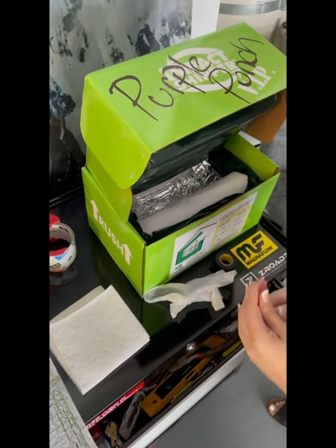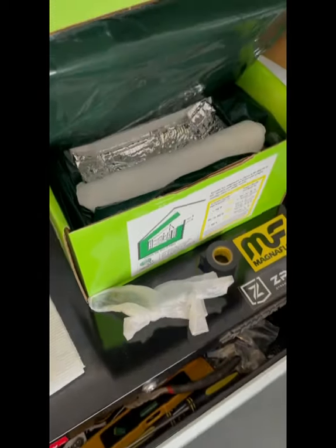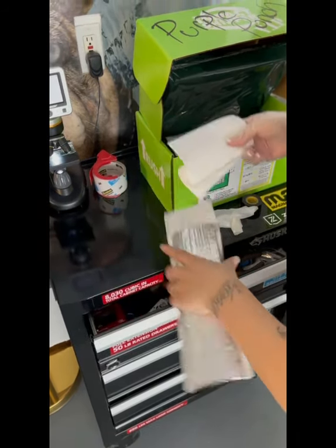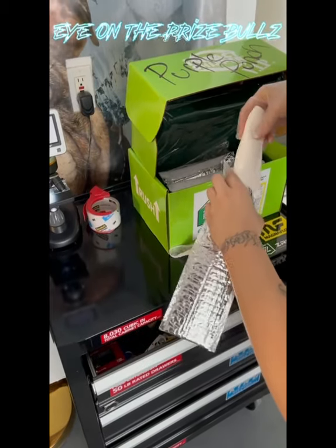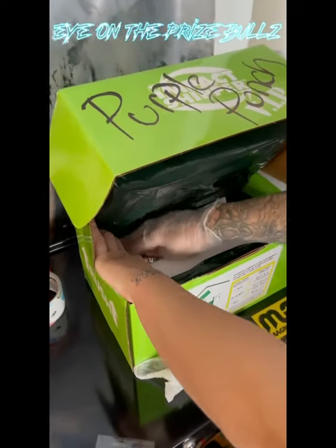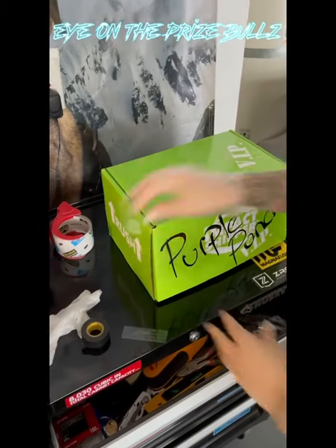This is the box. We usually put the name of the dog on the box so there's no confusion. The box comes with very simple instructions. Ice packs — very simple. We're going to wrap up the vial with a layer of paper towel as well. This pouch is going to further protect the semen.